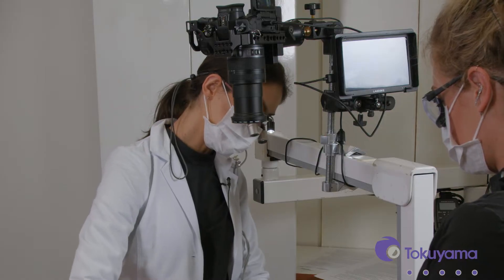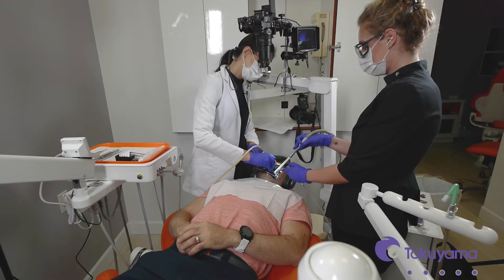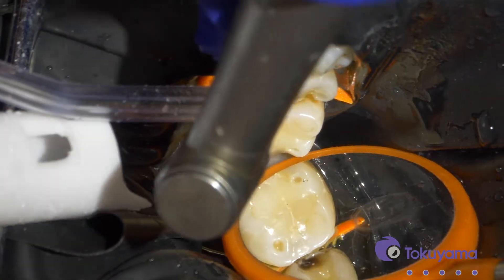I'm just removing all the old composite. There's an open margin. The molar may have something too, but we'll do it another time. There you can see some decay there, so let's get rid of it.